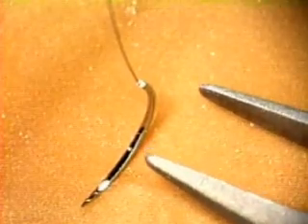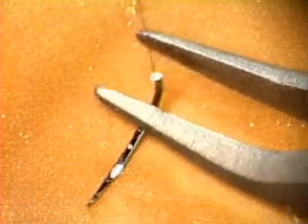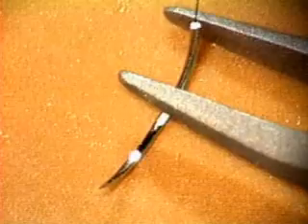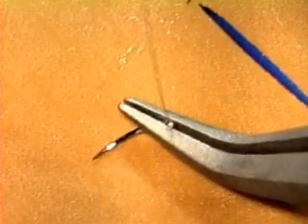Just a point of detail. As you pick it up, touch the needle first with the near jaw of the instrument. That way it'll go on pointing where you want. If you touch the needle first with the far jaw, it's easy to knock it out of position.